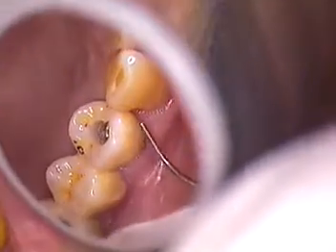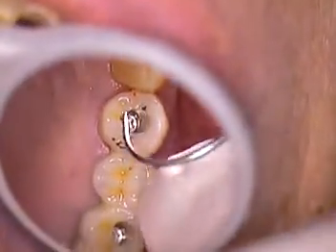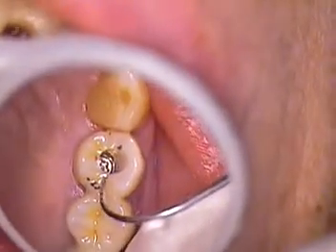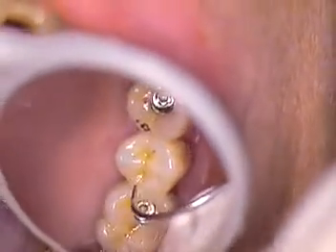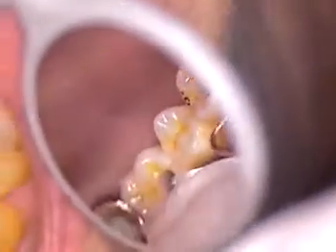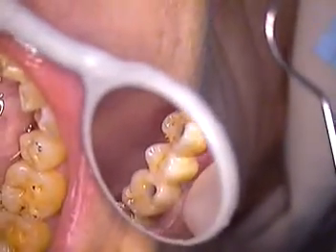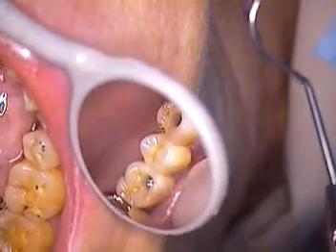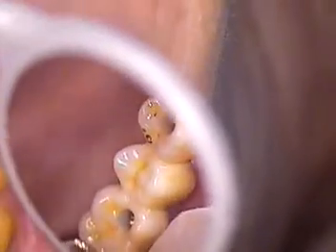At least the tissue we wouldn't adjust. Sometimes we have to adjust the occlusion, although she's hitting here on the first bicuspid — we haven't torqued the case down, so that will be rechecked. We're at the point where we're going to go ahead and torque her case in. I just wanted to show you the aesthetics as well on this really nice case from the lab that I use for the zirconia bridge work. It is one piece, no layering at all, and I think you can see by the aesthetics here, it's just amazing — and strength as well.